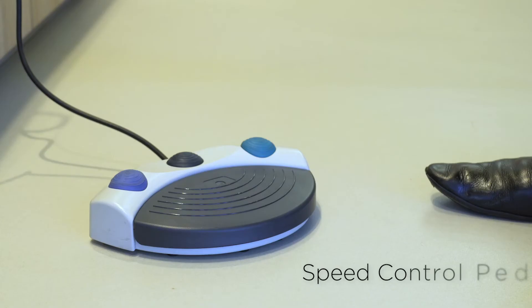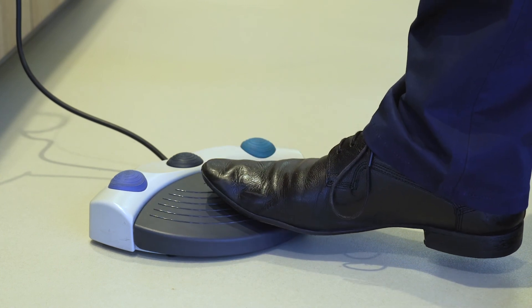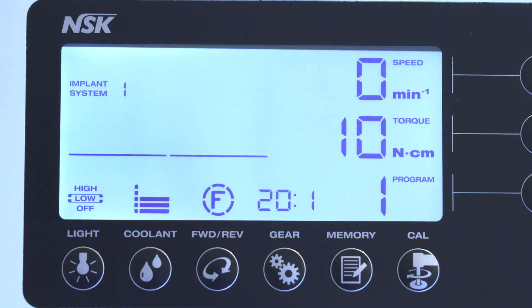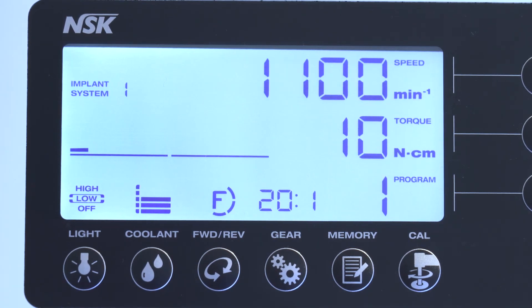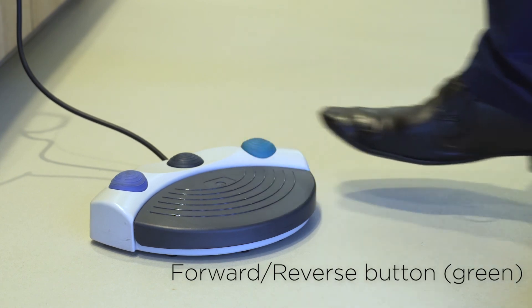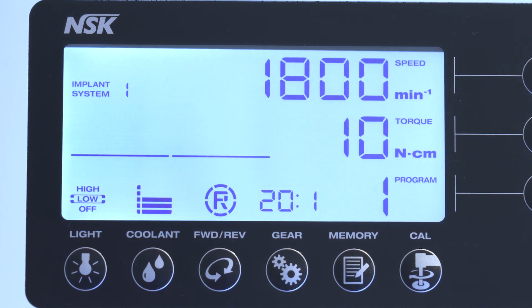Speed Control Pedal. Use to start and stop the micromotor and control the speed during operation. The micromotor operational speed is directly proportional to the position of the foot control up to the preset maximum. Forward Reverse Button Green. Use to change the rotational direction of the micromotor. Push once to change the rotational direction.